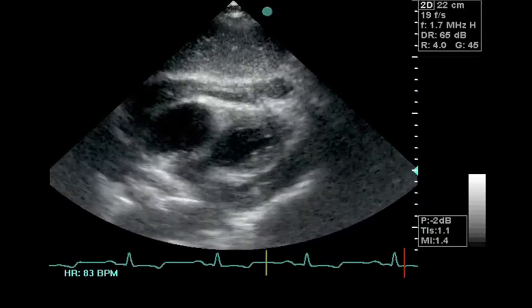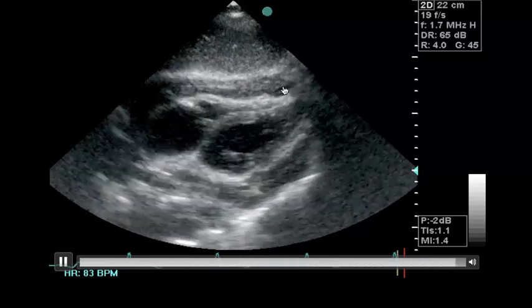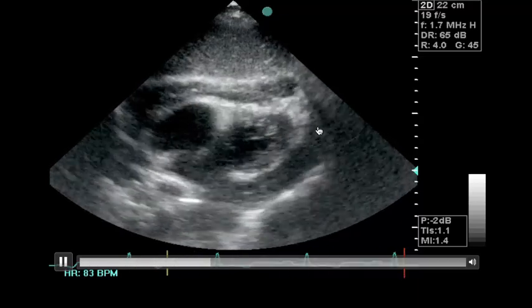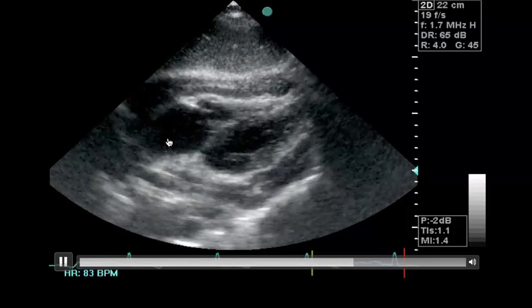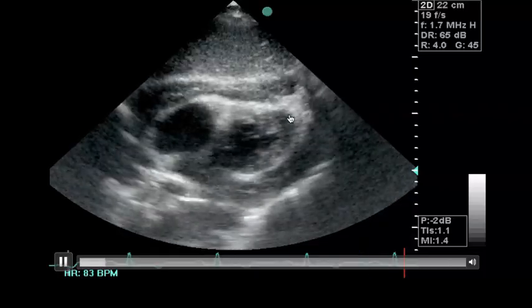Another example you can see here for a different type of ultrasound machine, again a cardiac probe, and you see that through the liver you see this more echogenic material, and inside you see the heart beating, but it is basically in a box, in a coat of fibers.